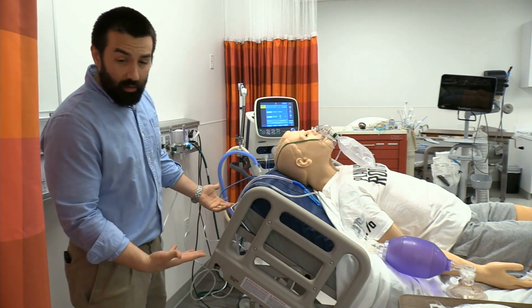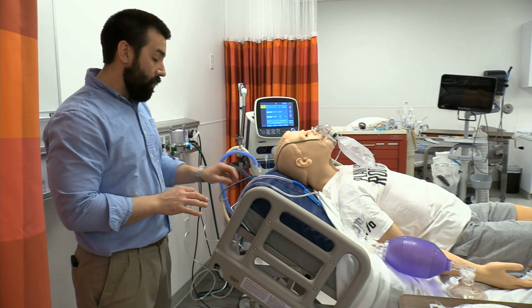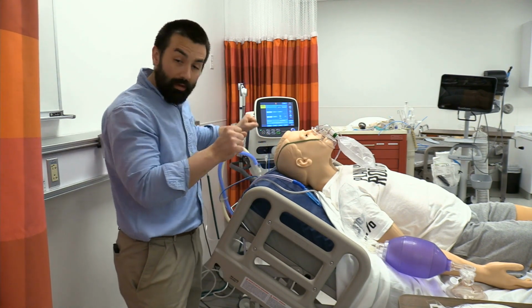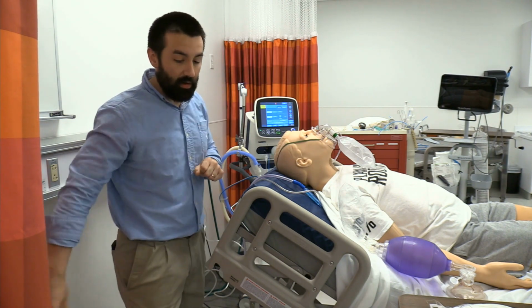If you haven't already done so like we have here, I have the head of the bed, or the entire bed, pushed back from the wall to give myself a little bit of clearance. I also have the actual headboard removed. Ours are very involved at the hospital. You just pull it out, set it down on the ground.